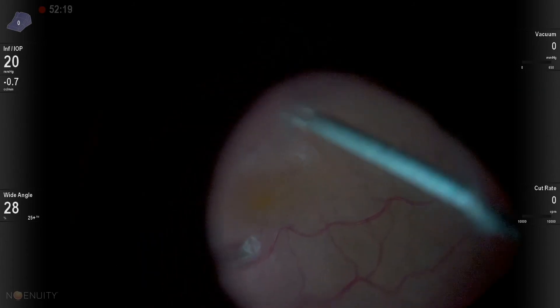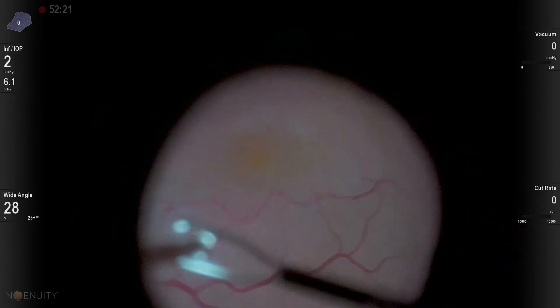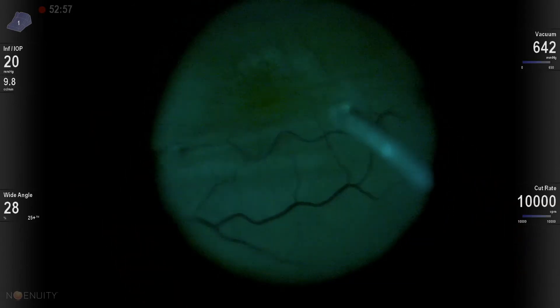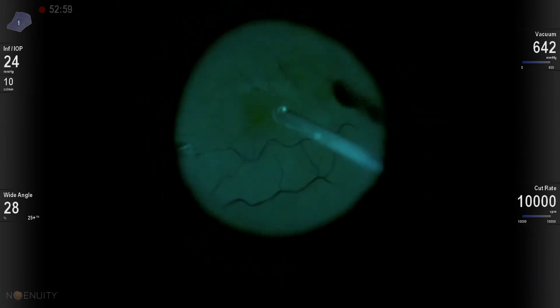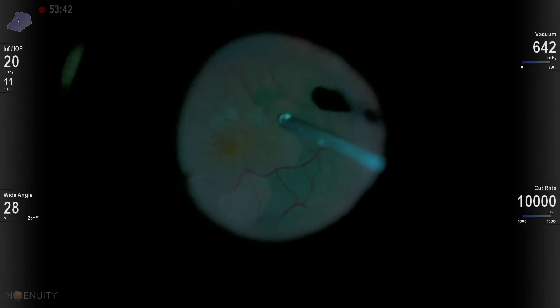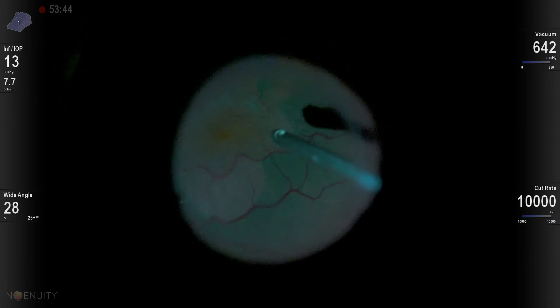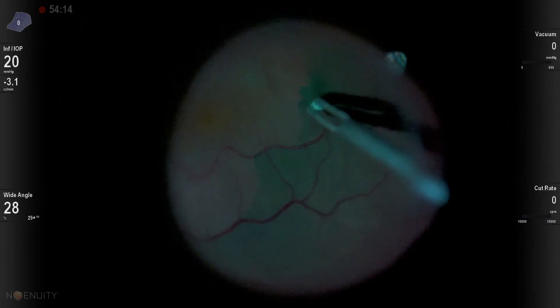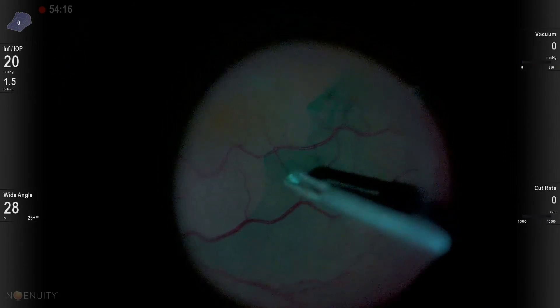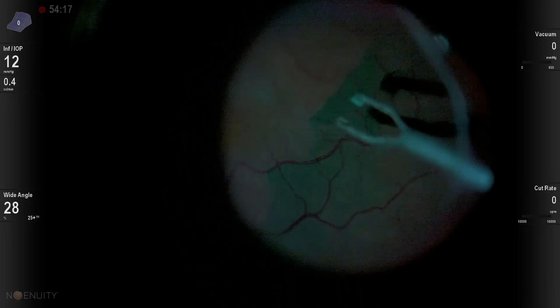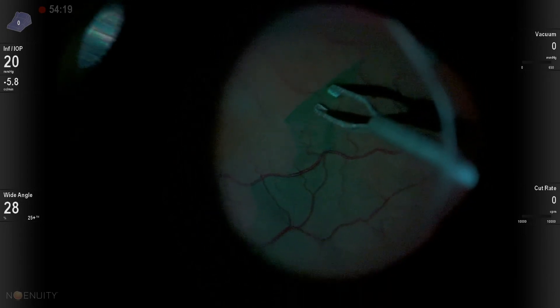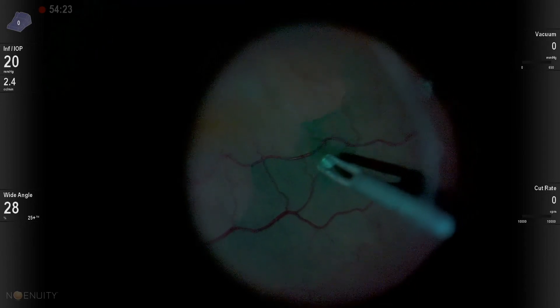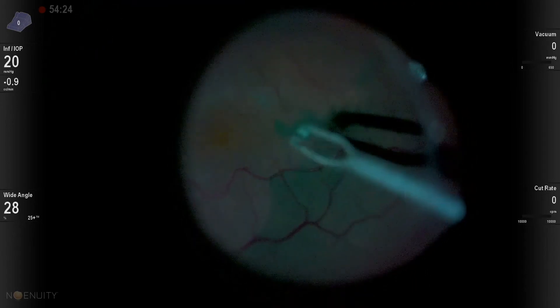I always like to go back and re-stain with ICG to make sure that I have the internal limiting membrane up. Having that internal limiting membrane gone reduces the recurrence rate in my experience from about 20% down to around 2%. And so I do like to enlarge that ILM peeling, but you can see here that the ILM came up for the most part on the back of the epiretinal membrane. So we'll just enlarge that a little bit.